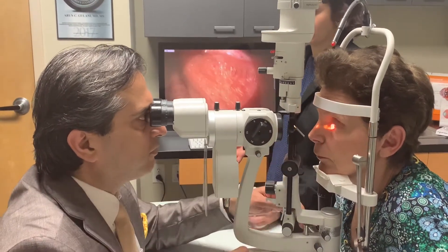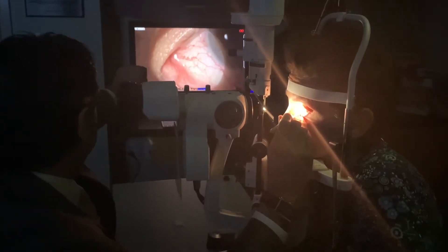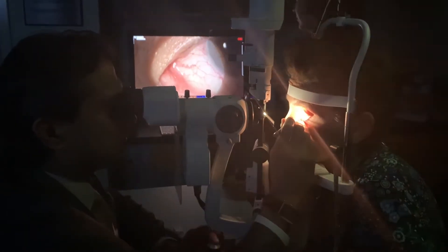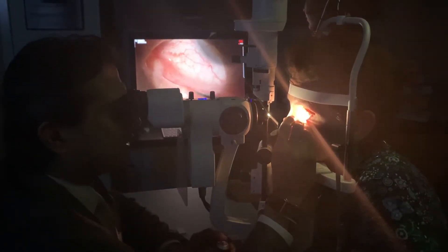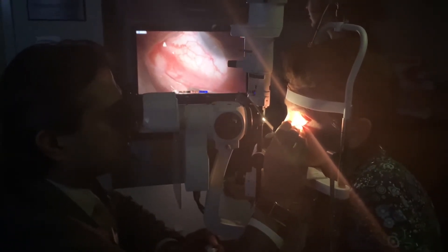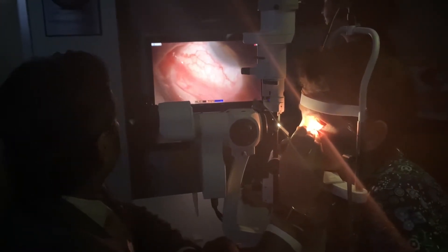You're all done. Come forward just for a minute. So, we have just completed inserting the dextensor into the lacrimal punctum and going down the canaliculus this way. You can see the fluorescent tip of it right here.